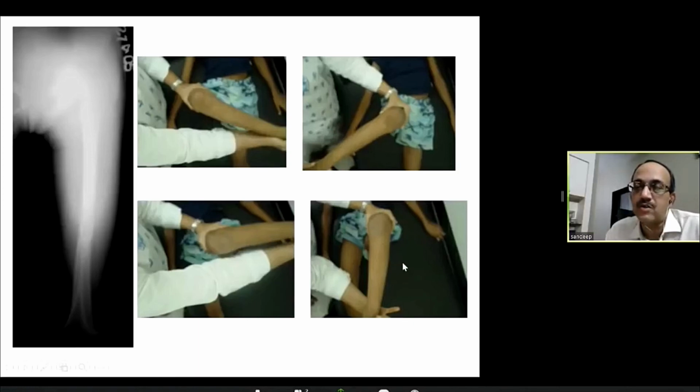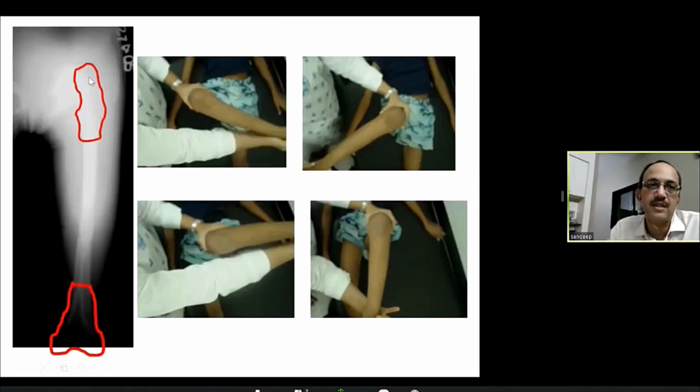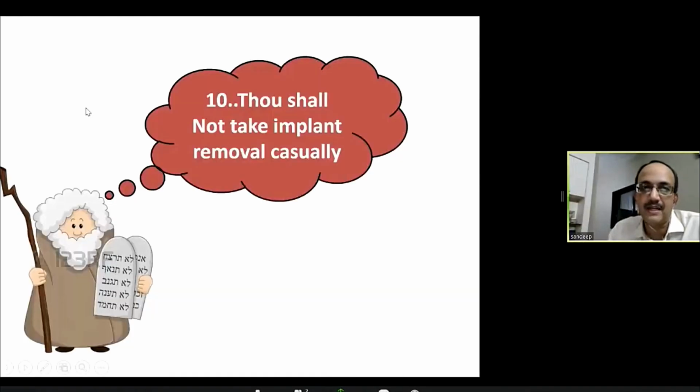So what has happened is that in a transverse fracture, you can end up having 45 to 90 degree malrotation and you will never make it out on the X-ray because the fracture alignment will look perfect. So it's always important at the end of the surgery to check rotations, especially with transverse fractures, so that you make out that there is no malrotation which can cause a problem. If there is a malrotation, you will need to withdraw the nail and turn the fragment around. Now, if you see this X-ray, it shows AP here and lateral on the proximal side. So this is malrotated by 90 degrees.